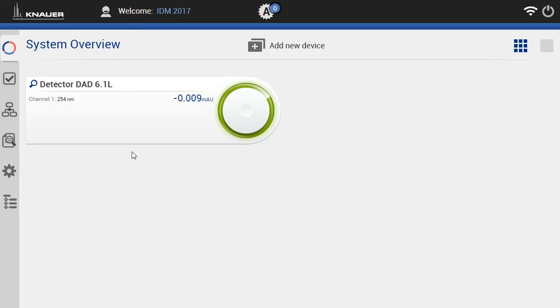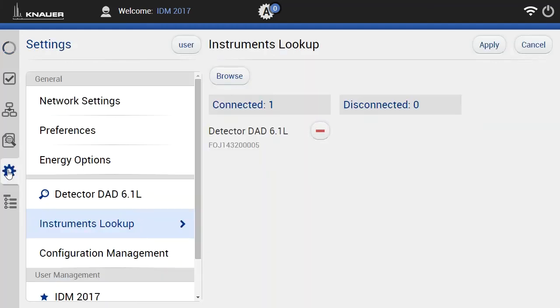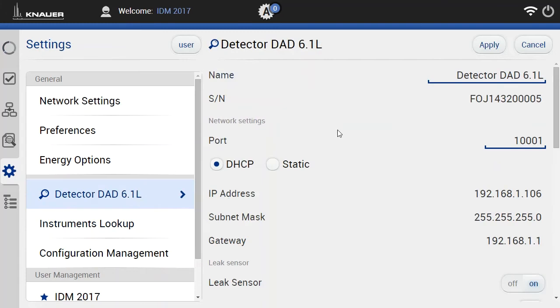In this example we have connected the software to a diode array detector. To change the IP address you just go here to the settings section, choose the instrument itself, and here the software lists you some information of the instrument.